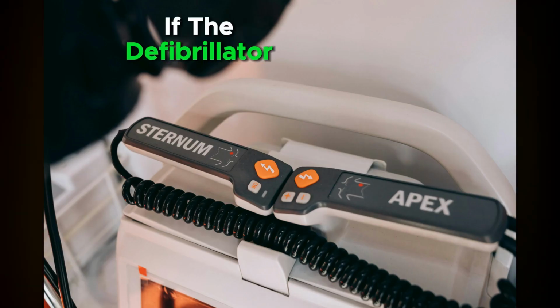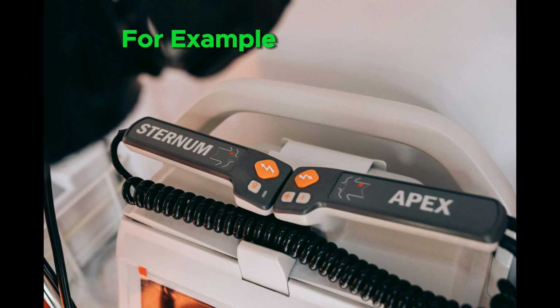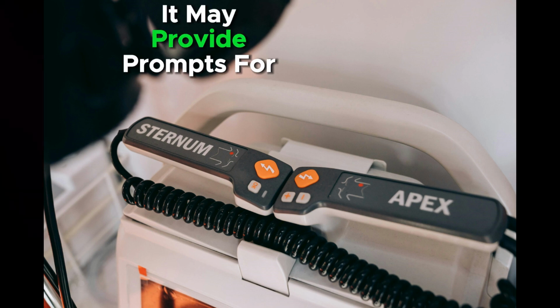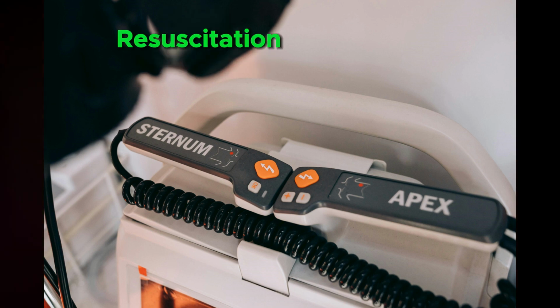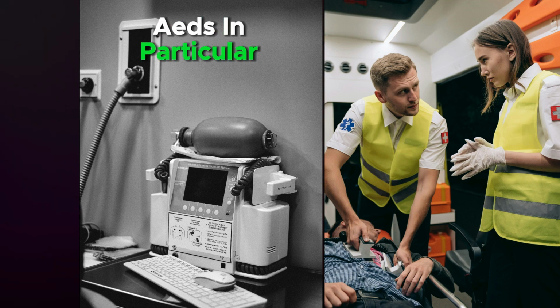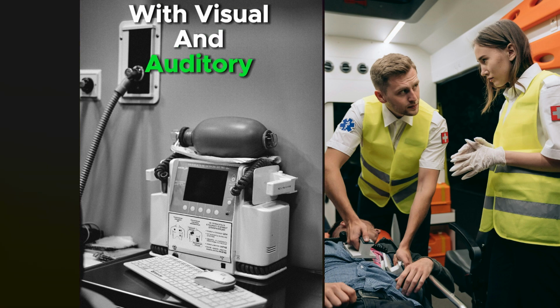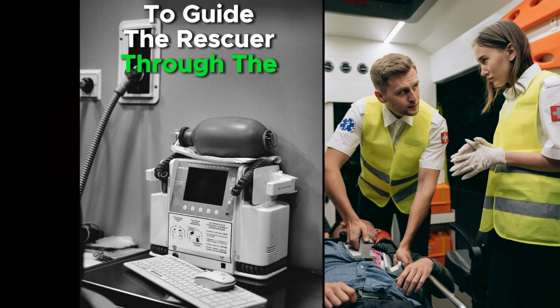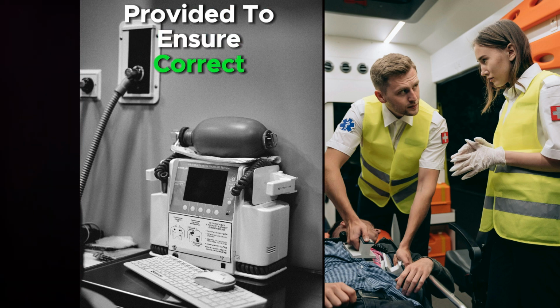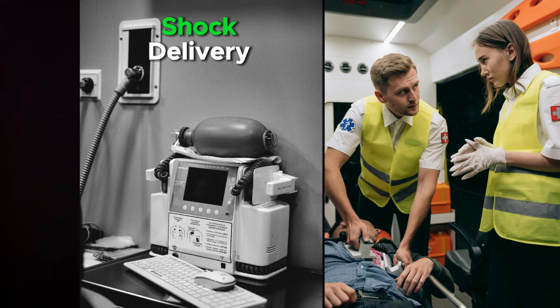If the defibrillator determines that the heart rhythm is non-shockable, for example, asystole or pulseless electrical activity, it may provide prompts for cardiopulmonary resuscitation, CPR, instead. AEDs, in particular, have user-friendly interfaces with visual and auditory prompts to guide the rescuer through the process. Clear instructions are provided to ensure correct electrode placement, analysis, and, if needed, shock delivery.